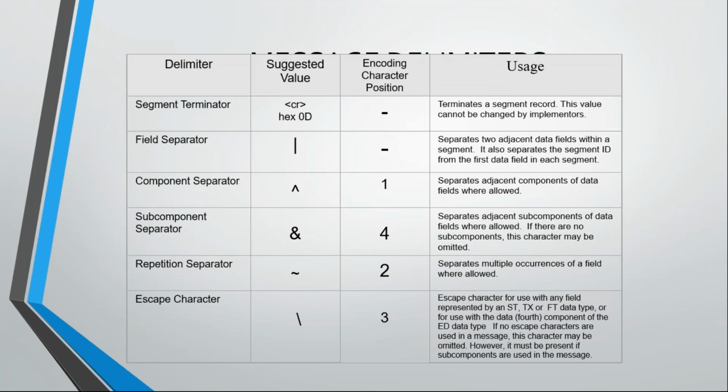So while writing English language, we have seen that a full stop is used to terminate any sentence. A comma is to give a gap or a pause to the sentence while reading it. And we have other grammatical expressions as well. Similarly, in terms of HL7, we have something which we can compare to our English language.